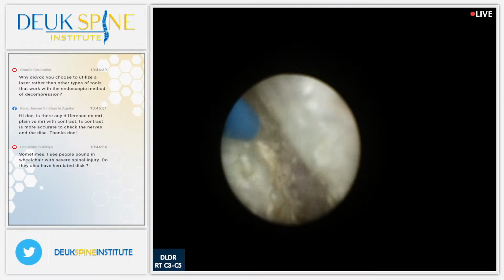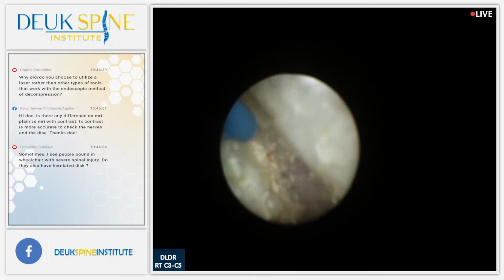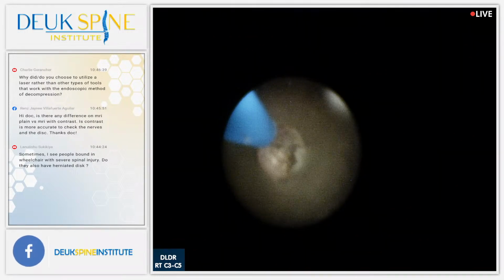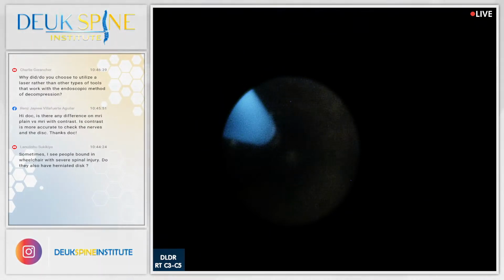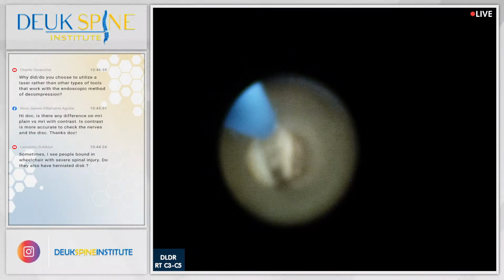we are literally in the foramen. That's a half a millimeter fiber, by the way. I'm going to check the other direction and we'll be done with this disc. I think there's still a piece of herniation over here. Yeah.